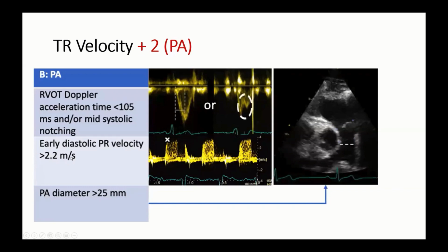These are a little bit complicated things that we don't usually do. Or the pulmonary artery diameter is more than 2.5 centimeters, which you'd be surprised that with a lot of patients, you can actually get a picture that looks like this, where you are in short axis, you go up to the aorta and tilt up just a little more towards the head of the patient, you see the pulmonary artery in there splitting into two. The same way you see it on a CAT scan.